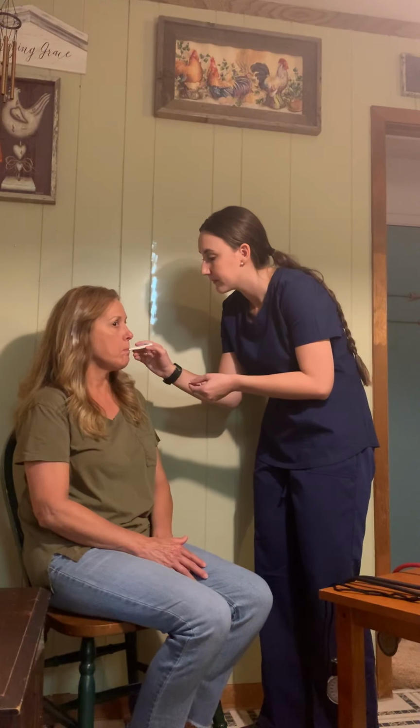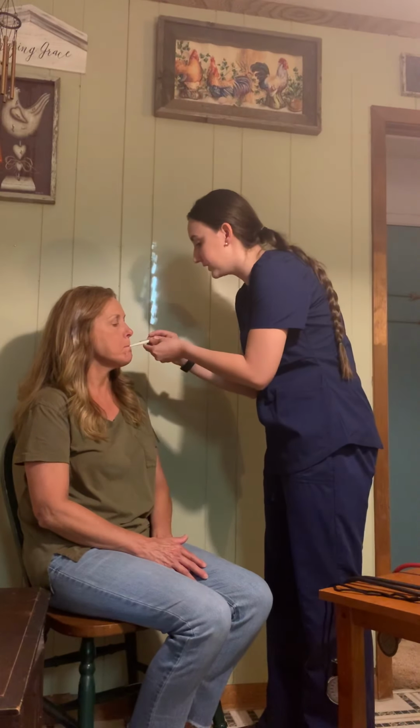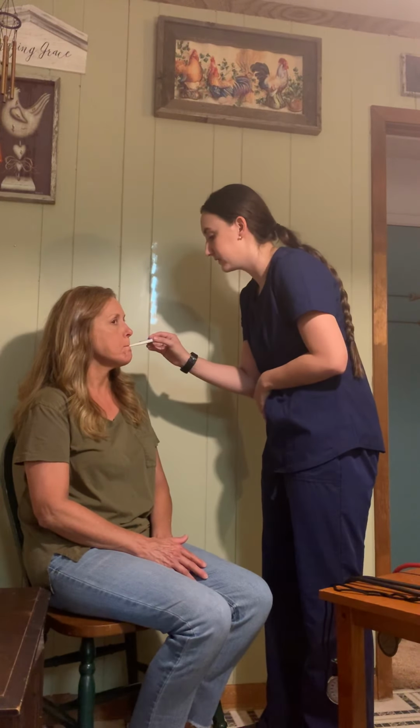So next is your temperature. We're going to use an oral thermometer. I'm going to place this underneath your tongue, and you're going to close your lips. So this should take about 10 to 15 seconds.